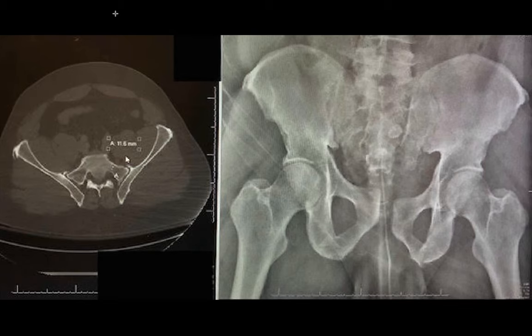So this case may likely not be of interest to anyone other than orthopedic trauma surgeons, but maybe some orthopedic surgeons can get something out of it and at least see the thought process behind how we treat some of these pelvic fractures, particularly in the setting of dysmorphism, as is the case in this particular patient.